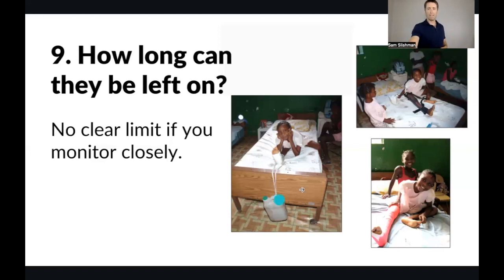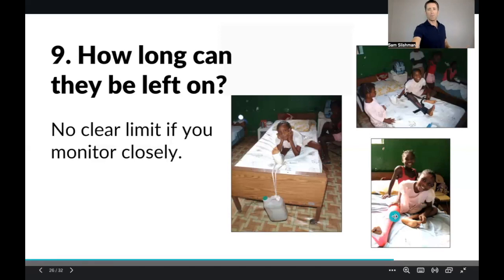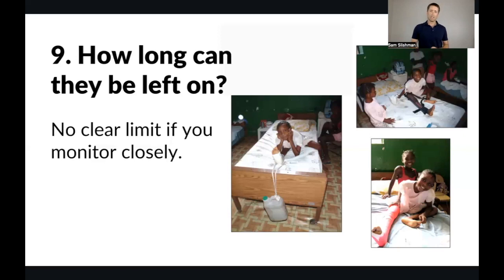So what I did was I took a lot of these off, put the traction splints on until an orthopedist could take the patient to the OR and do whatever type of fixation they wanted to do. The longest any of those splints were left on while I was there was, I think, up to 10 days. Once a patient went to the OR, then we cycled them and gave them to other people.